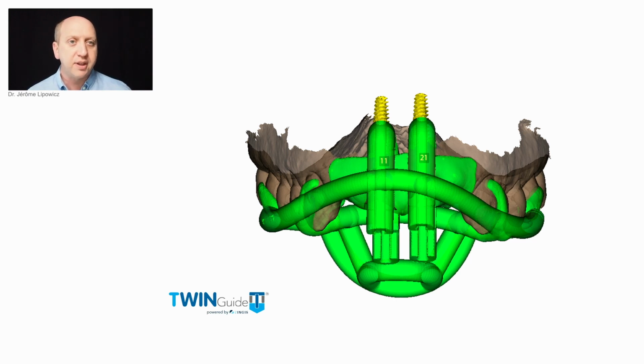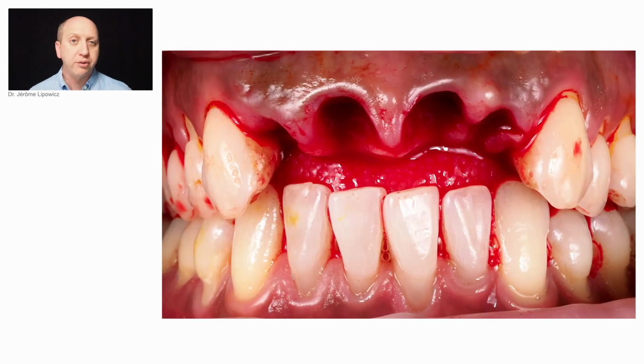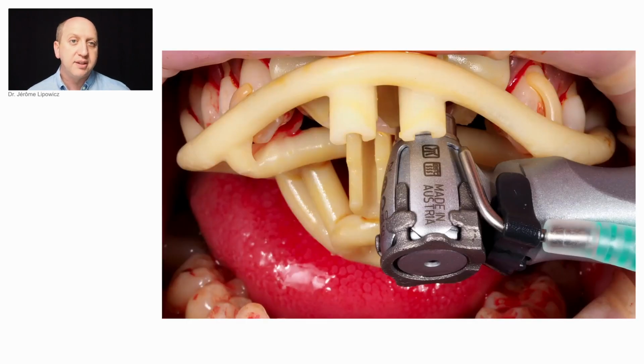It's a very interesting concept where the templates are designed and held like dentures. It's not the drills that are guided, but the whole contra-angle. So after spending some time on the computer, it's time to operate. But all the decisions were made earlier on the screen because we aim to act fast for the patient's best interest. Since the implants are quite deep and placed into anterior empty sockets, I couldn't do that without guided surgery.